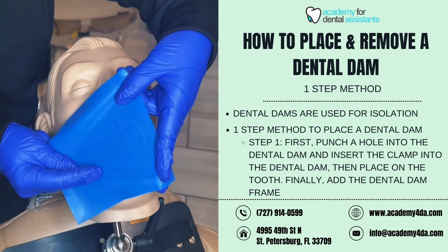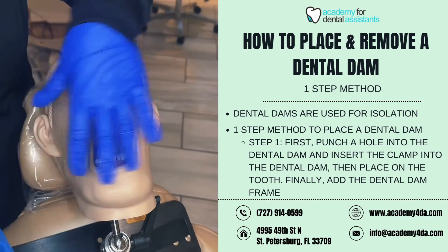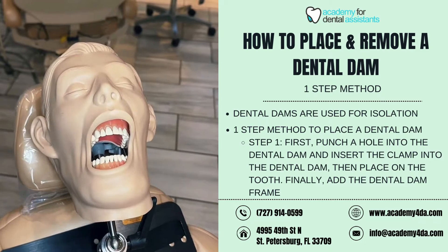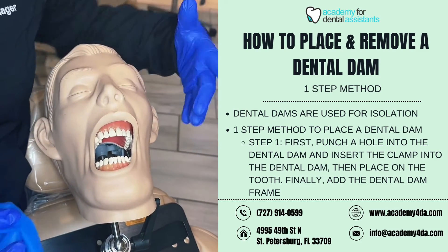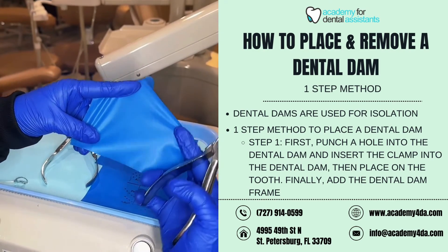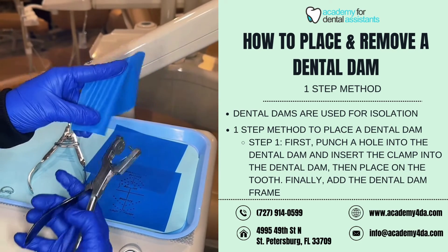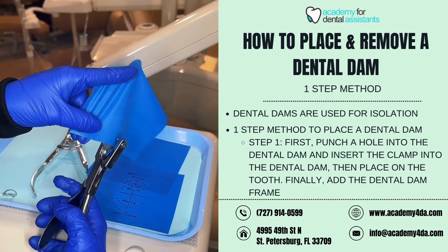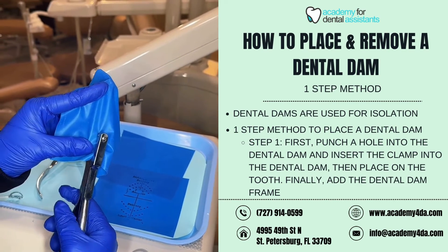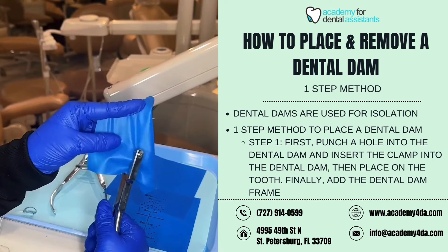When placing the dental dam, tooth number 28 is going to be roughly right about here, and I want my dental dam to sit up like this on the patient. You can guesstimate where it will be, or use the dental dam stamp to help estimate placement. Now that I've measured where I want my punch to go, I'll grab the dental dam punch, position the dental dam between the hole and the harpoon, and squeeze tightly to create the hole.